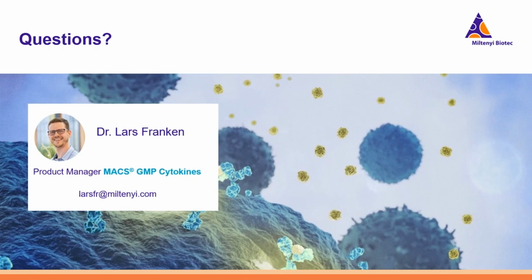If you have no clinical version of the cytokine available, you might indeed be able to use research use only products for a process. But the further along you go in the clinical development, the more difficult it will get. And when there is a clinical or GMP version available, then usually the regulatory body will make you use this version. I hope this answers the question.